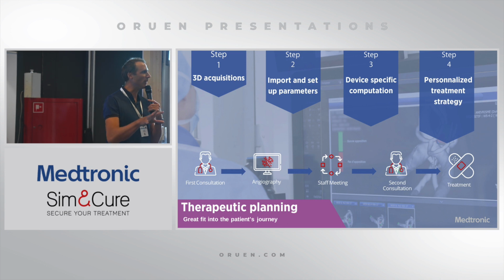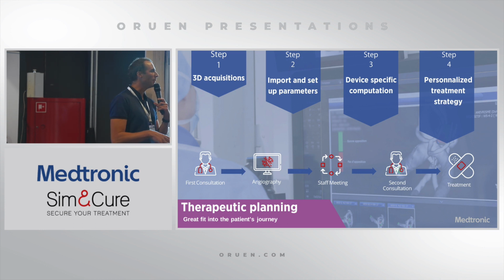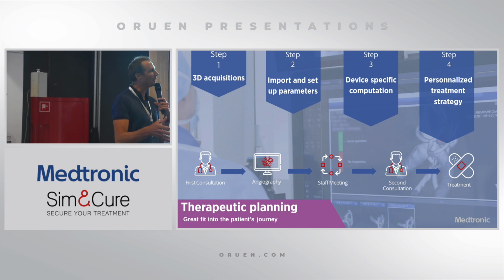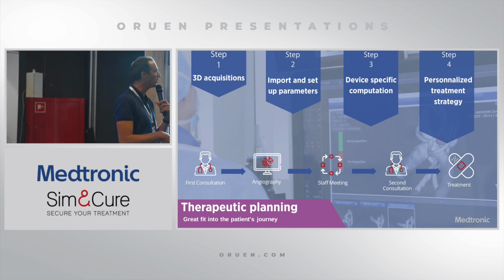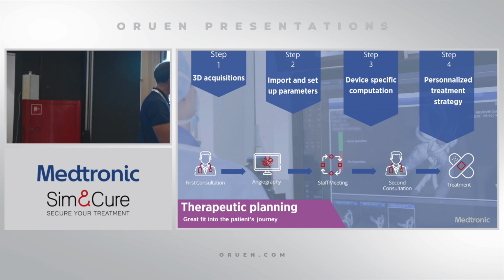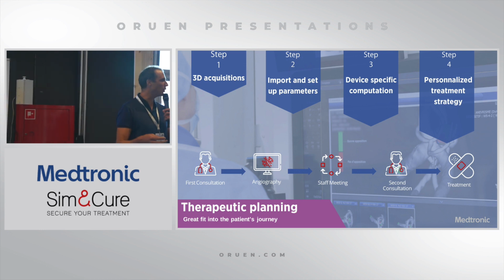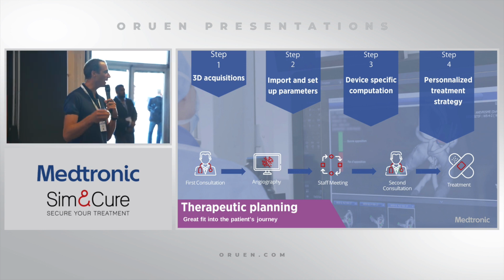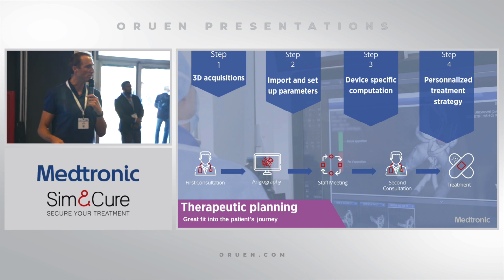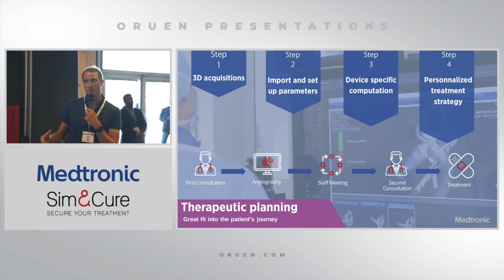In clinical practice at the moment, I would say that we use this numerical interface not just for the simulation phase in the angio suite, but we also use it with the patient, meaning that we make a first 3D acquisition when we are doing a diagnostic angio, when we just discovered the aneurysm in the patient. So you make a diagnostic angio, you make a 3D run, and you will anticipate the treatment you will perform on the patient in the next 2 weeks at your desk. So you can anticipate what could be the good devices.